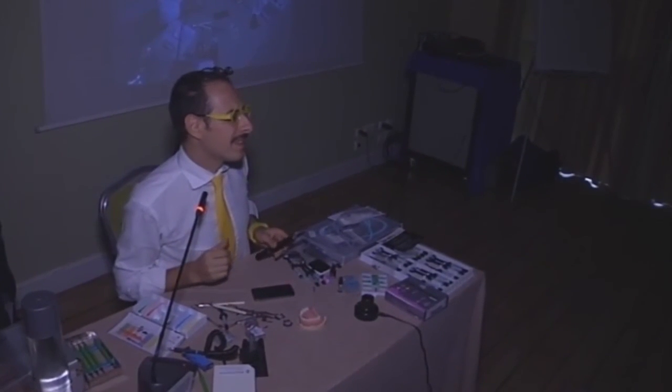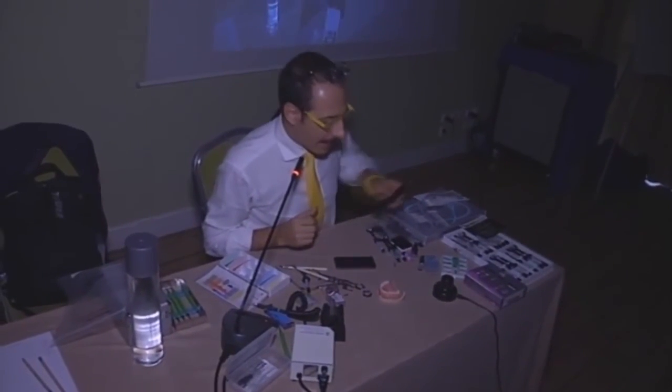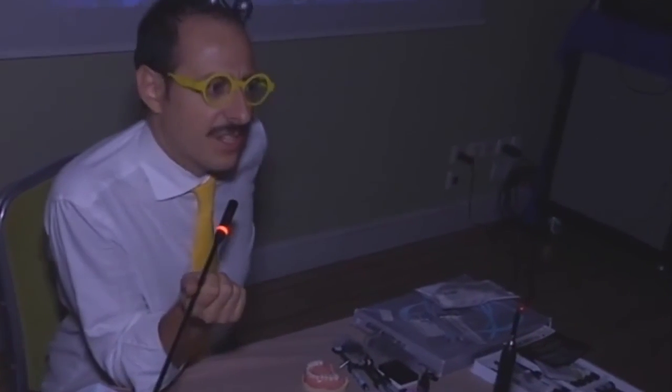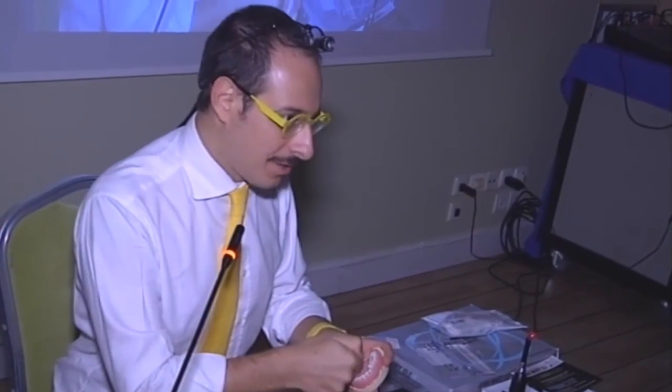When is the right time to use the OxyGuard again? After the last layer, before the finishing and the polishing procedure, you completed the restoration. You placed eventually the brown. Okay, so it's done. You light cure without OxyGuard. So you place the last layer of composite, you light cure the last layer of composite. You check you do not have to add any more material over there. You place the OxyGuard and you light cure again.